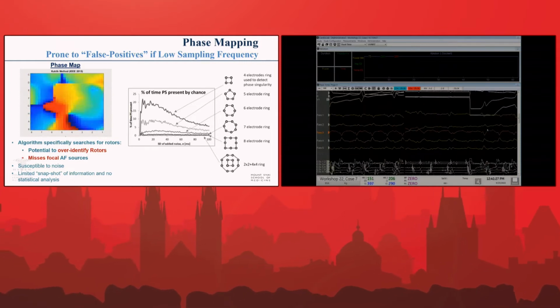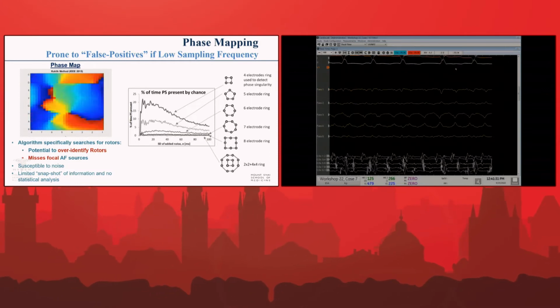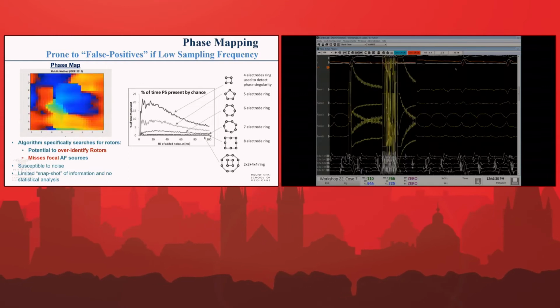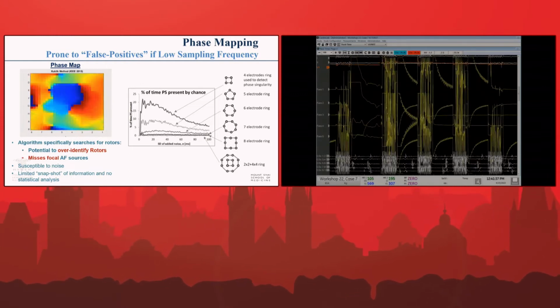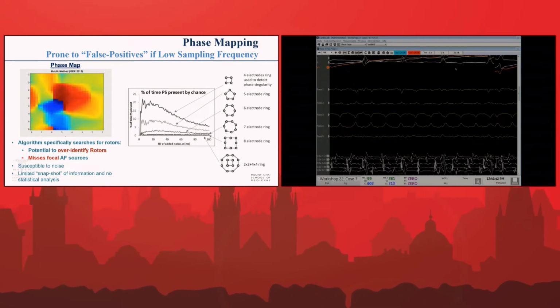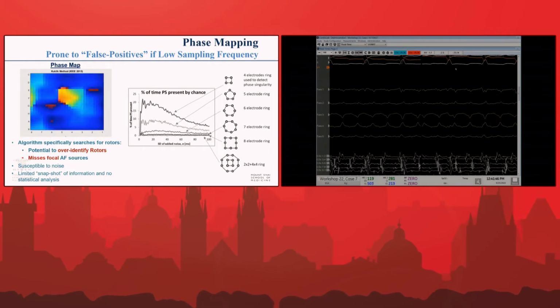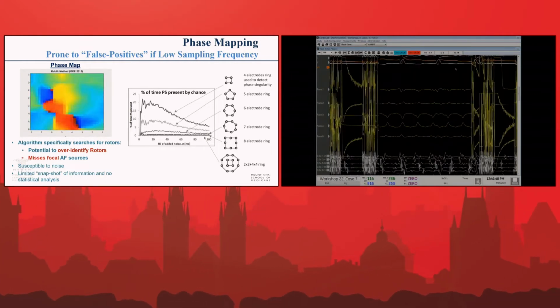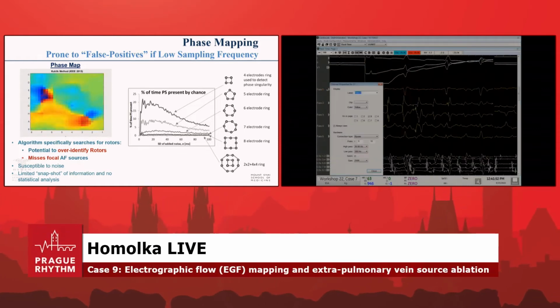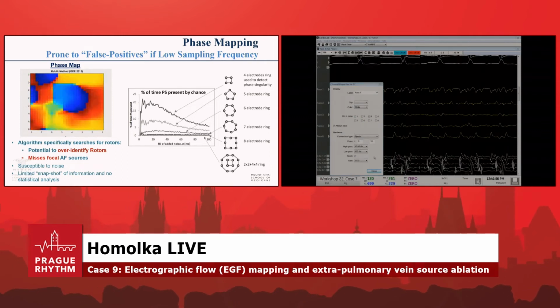The graph on the right is really a very useful one. This was a study that was published a couple of years ago where the investigators put different densities of electrodes. On the bottom, you have this complex thing with I guess 10 electrodes. On the top, you have just 4 electrodes. And then they created noise, and they asked, can you identify rotors in what was essentially noise?